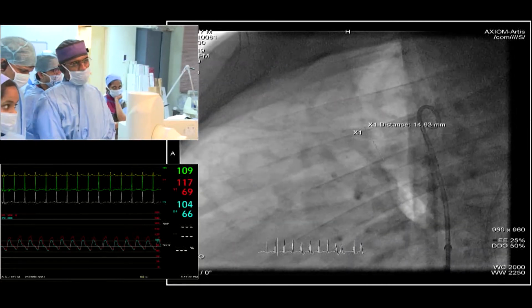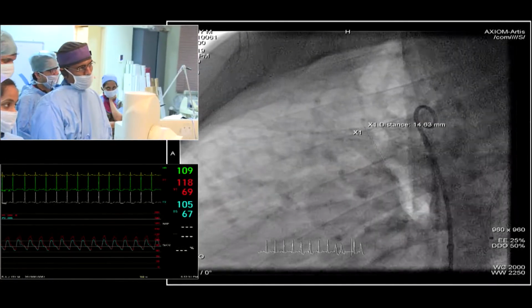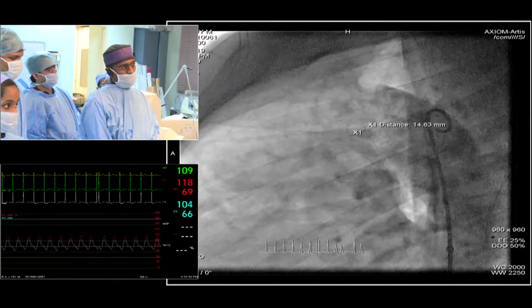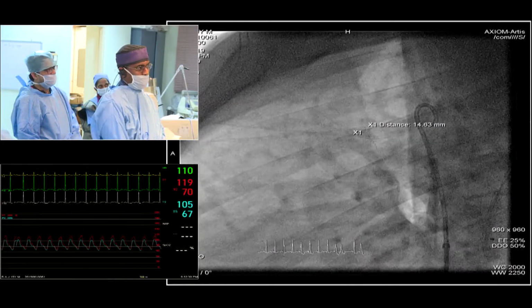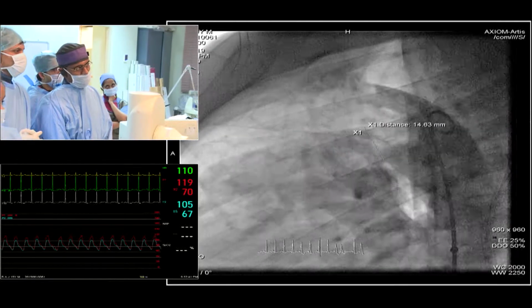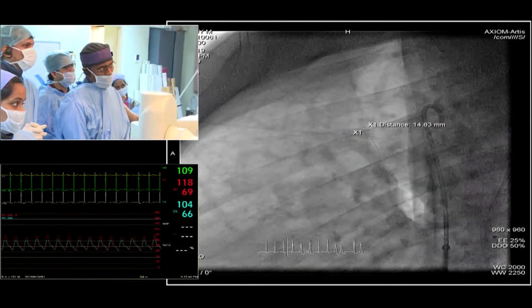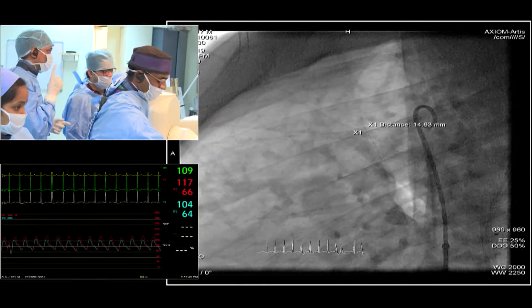Since this session is on cath lab efficiency, I wanted to just show how this particular procedure should be done. Basically, we need to occlude the distal part of the aorta. If you carefully look at this image, I have a Ty-Shak balloon that is floating in the descending thoracic aorta. Can you see the dots there? Yes. So now, get ready for the next angiogram.